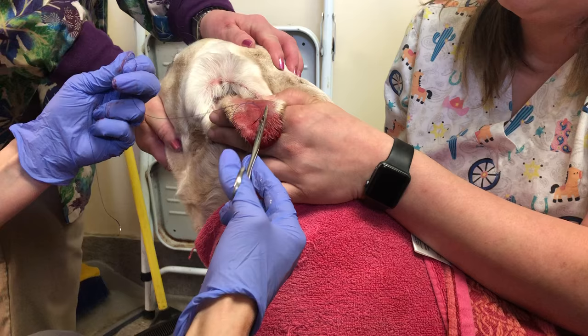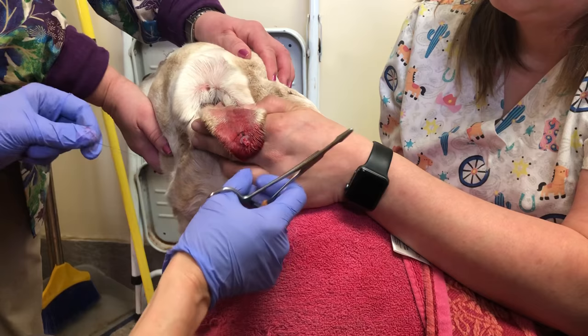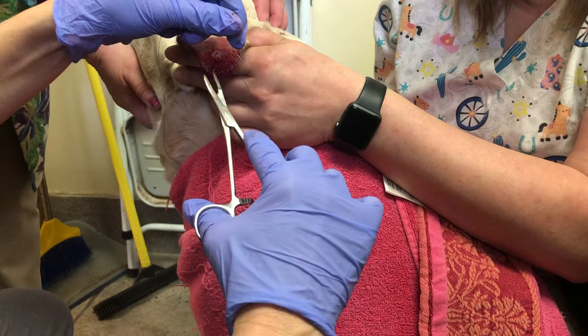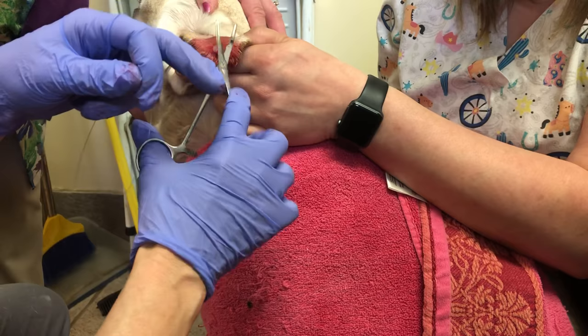She will go home with an e-collar on. The e-collar and the drain stays on for three weeks, and then the drain will come out. The owners at home have to make sure they keep the drain patent — keep the end of that drain from clogging. There's a little hole in the end; just make sure that doesn't clog. And then relieve the itch. The biggest thing is to get the underlying cause or else all of this is for nothing. E-collar, treat the underlying cause, keep the drain open, and come back in three weeks.